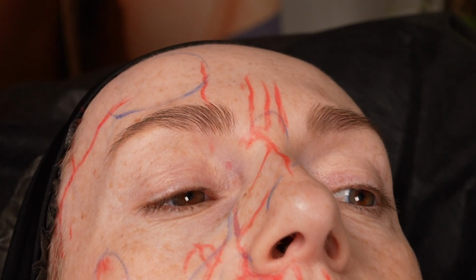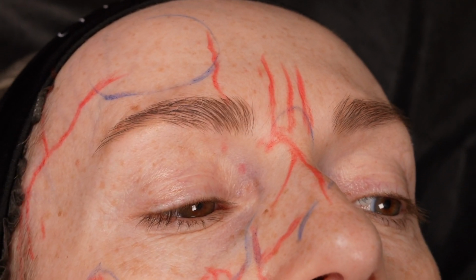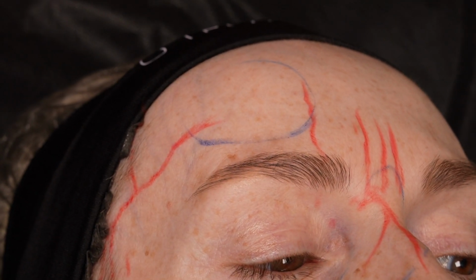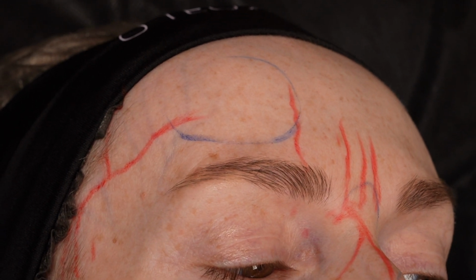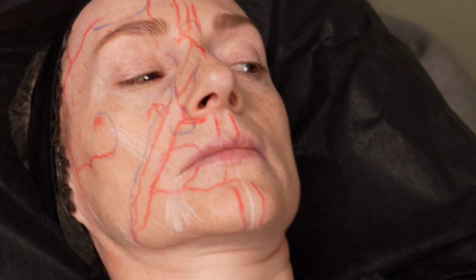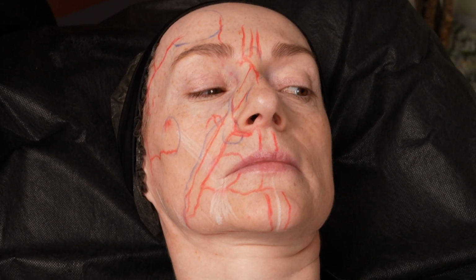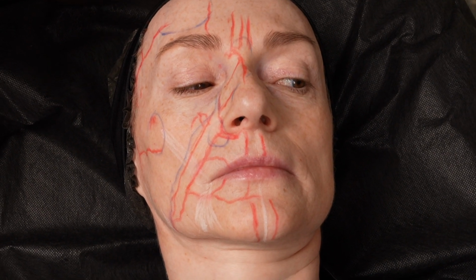I don't need to open one cannula. I can also inject deep injections in this area with a needle. I don't know if you use a needle or not, but I like the needle somehow, so I use a needle also in the mid-face. No? You do? Yeah, good, of course.